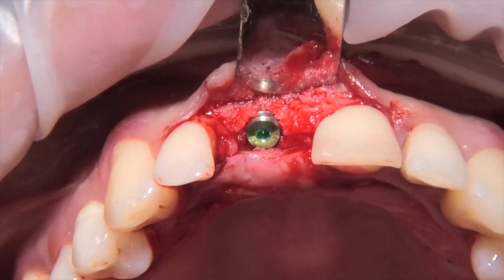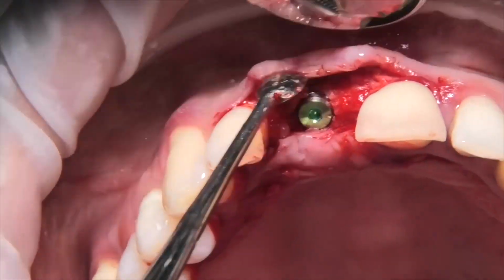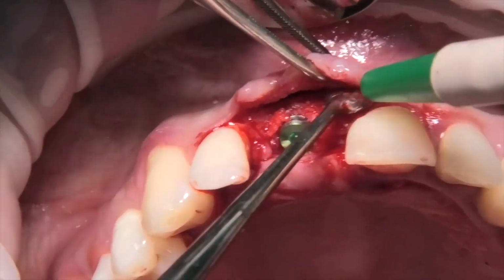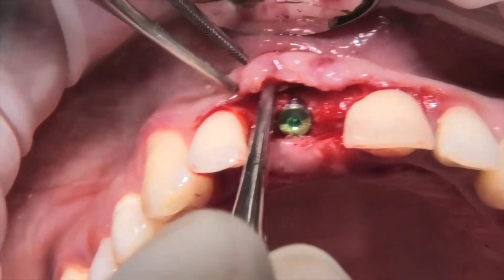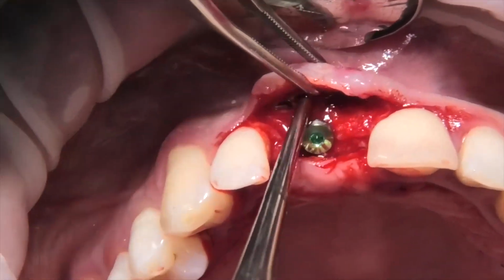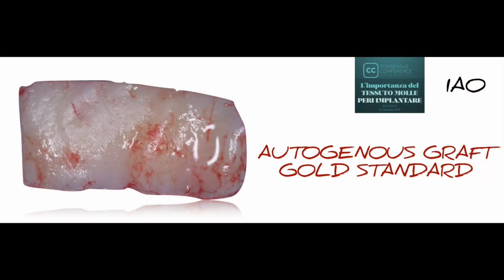So now we can see the right position of the crest of the bone. And so we can make an incision with a scalpel and a new 15C blade in the bottom of the flap.